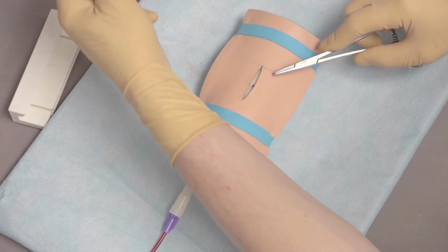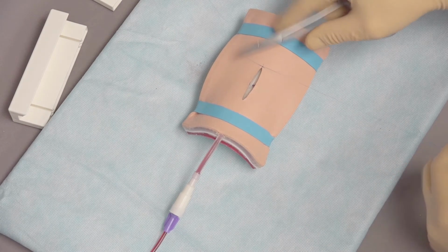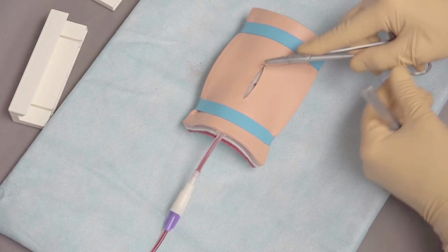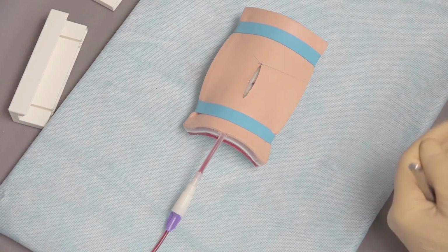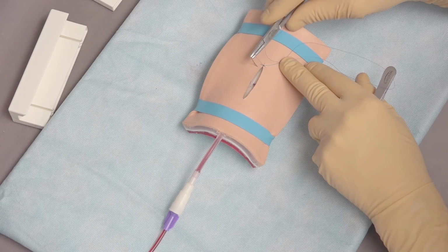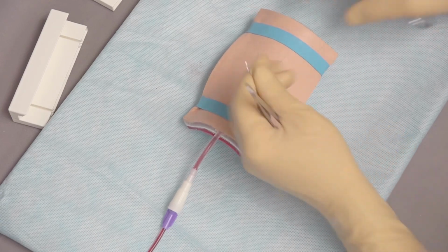A straightforward square knot in this case will be plenty to accomplish this, and we will go ahead and get this incision closed. So now to continue this on, we're just going to make sure that our bites are as even as we can make them from the cut edge as well as along the incision. So we want to be about 3 to 4, maybe 5 millimeters back from the edge, and we're going to go a similar distance, about 5 millimeters along the incision, and that will be our continuous pattern.